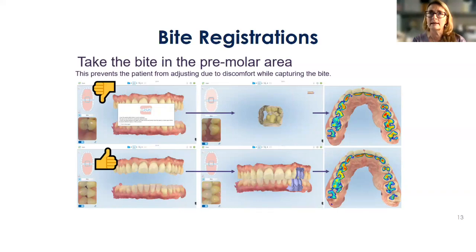I think it's a bit unrealistic and perhaps unfair to the patient to have them completely reclined. They've been anesthetized and numb for a good period of time after preparation, during preparation, and then we ask them to close normally. And they're like, what do you mean close normally? I'm upside down. So let's sit them up.